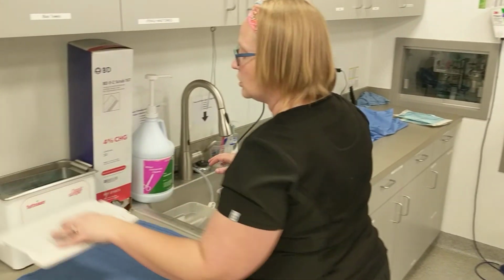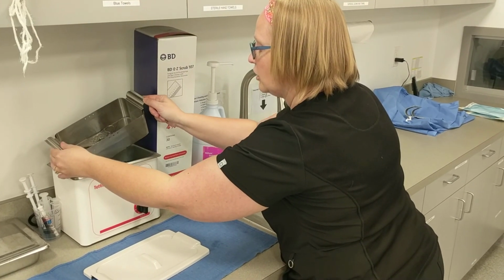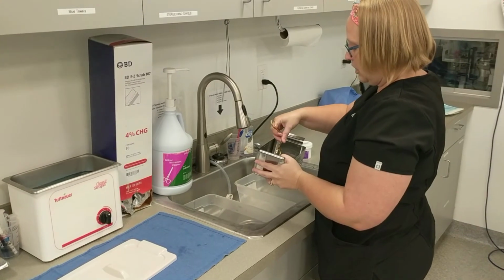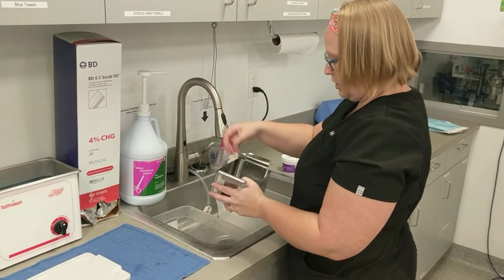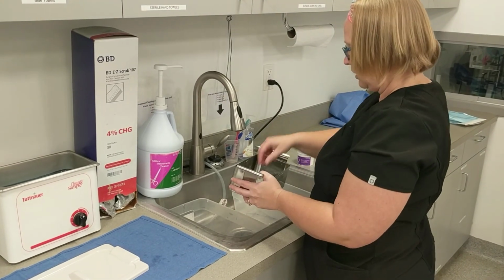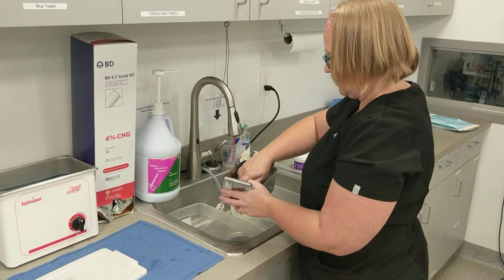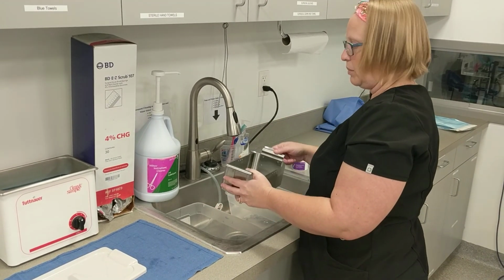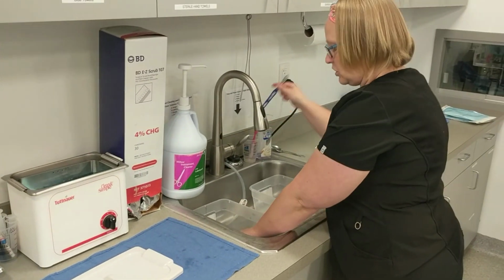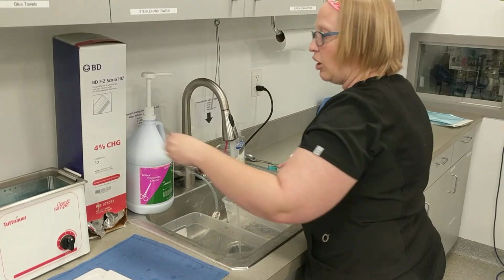So the first thing I'm going to do is empty the instruments that just finished out of here. It is recommended based on the instructions on this bottle that I rinse these, so I'm setting these in an empty, clean bucket for separate rinsing. The instruments that just came out of surgery, I'm just going to give them a quick rinse here, just to get any large debris off.